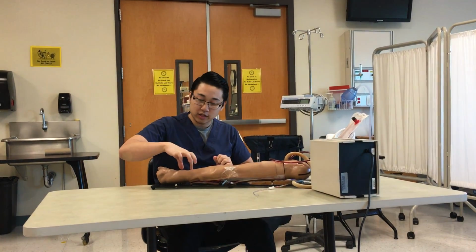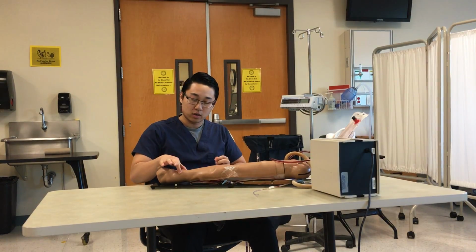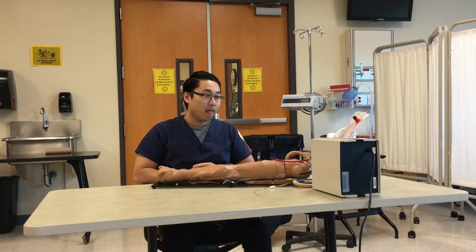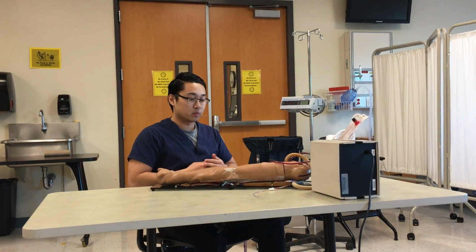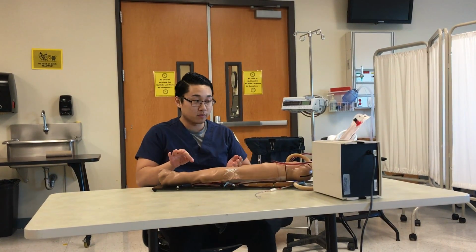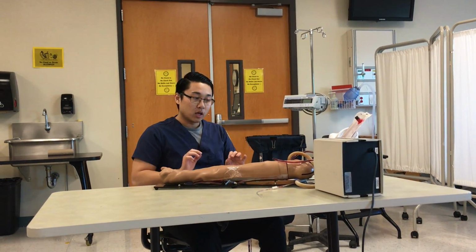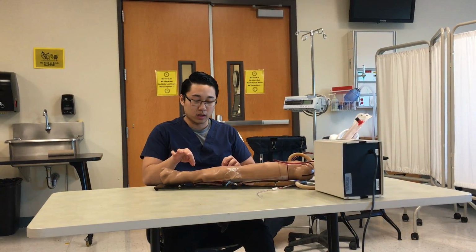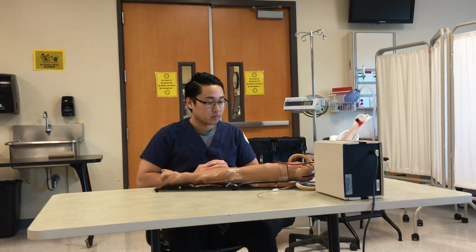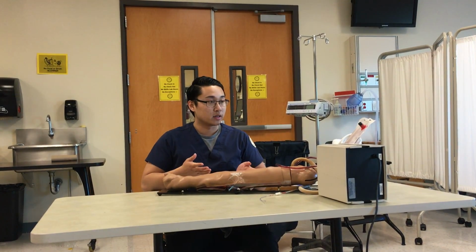I'm gonna check their identification. I can get their name and date of birth and confirm with their armband. I'm going to explain the risks to the patient. Some risks could be there's pain involved, slight pain. You can get skin infection, and also I can cause nerve damage. If the patient understands the procedure, as well as the family, I'm gonna go ahead.